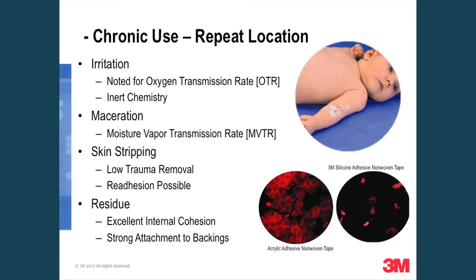That's why a lot of standard adhesives, synthetic rubber and acrylics, you can't put them back down and expect that same adhesion level. With the silicone on the right, it's only removed a few of the dead skin cells. It hasn't pulled any hair, and you can put it back down in that same spot without causing any more skin stripping to occur. And it doesn't leave residue behind. That spring effect, it stretches and removes itself from the skin surface, so you don't lose the residue. You don't see a lot of cohesive failure, which is internal failure, because of that stretch to remove effect that you get from the silicone.